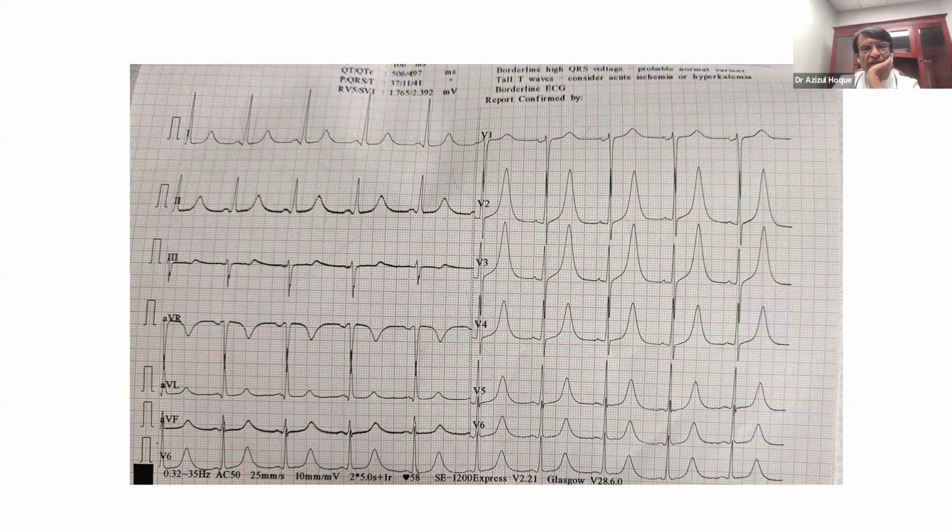Sir, can it be due to transient ischemia, as you said, due to high blood pressure at that moment, which reduced after using GTN and other antihypertensive medication? Right. But the point is, Tushar, usually when there is pressure overload, we have T inversion. When we have volume overload, we have upright T. It doesn't add up. We do not have a clear explanation for all these changes. But this is a very beautiful example of the enigma that the ECG presents to us.